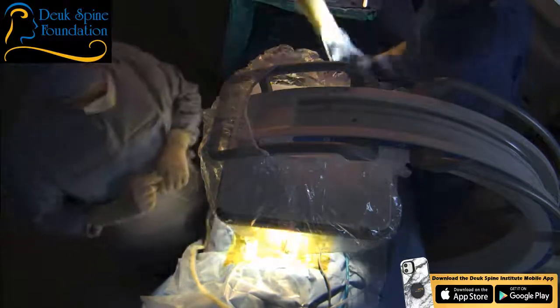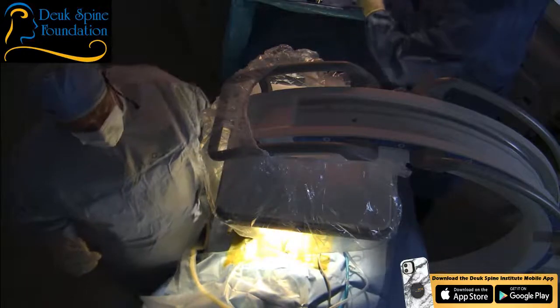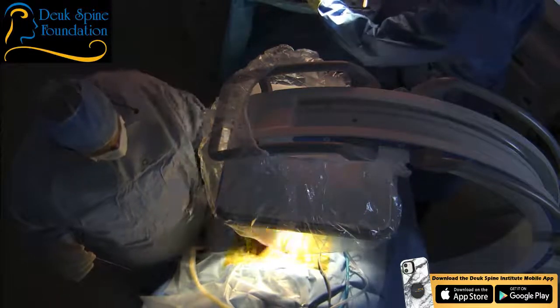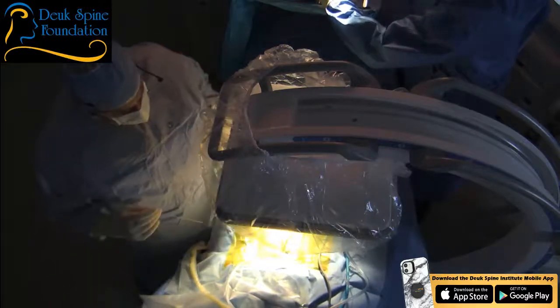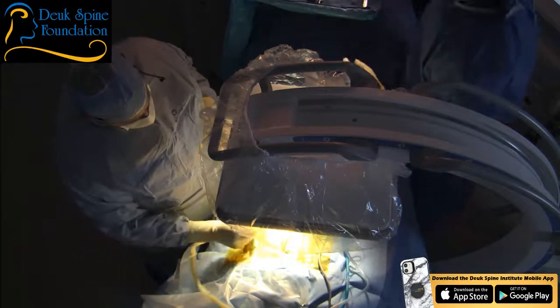Now listen, during the surgery I may ask you a question, okay? If you feel any pain, I need to know if the pain is in your back or if you feel it down your leg. So just say back or say leg, depending on where you feel it.